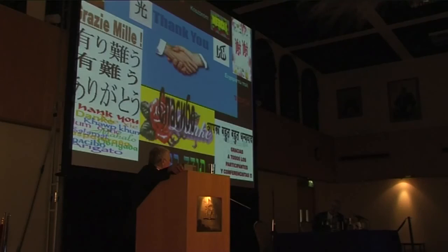The strictures that appear after removing the stone, we just dilate with a high pressure balloon. It's not the lecture. We'll have another lecture regarding the use of other techniques in dilating ducts. But what we did is very simple. We introduced a high pressure balloon and we dilated it. Good. And was the operation on the horse successful? Oh, yes. Very successful.